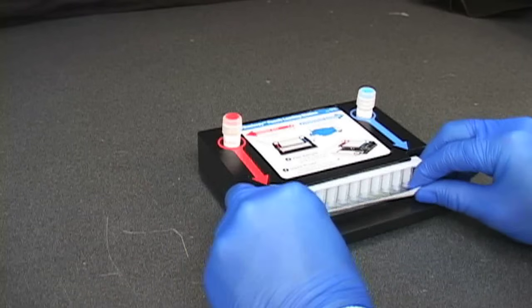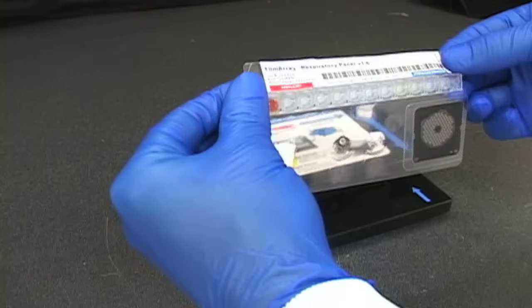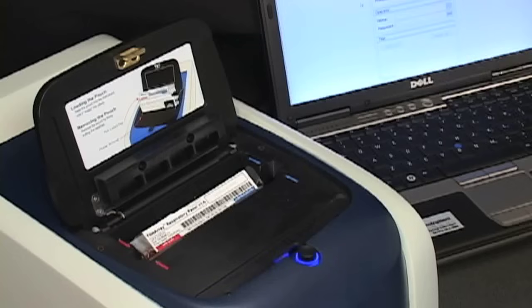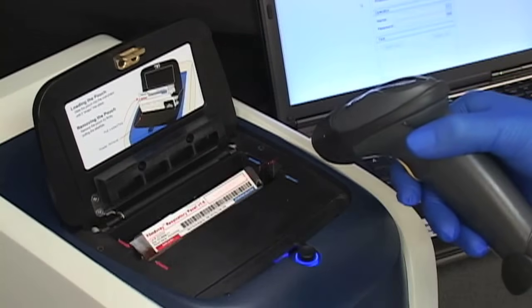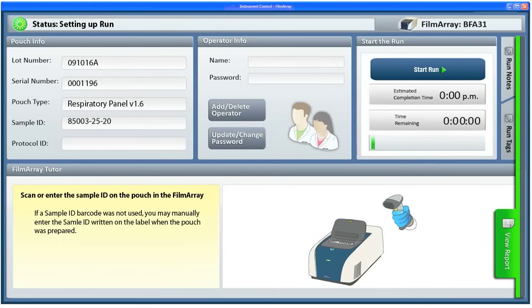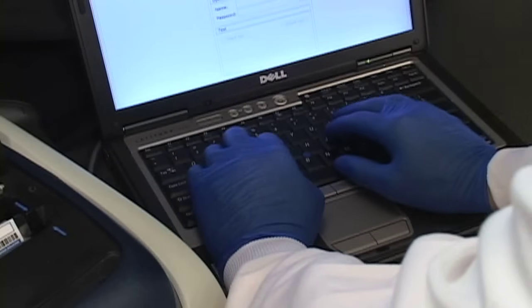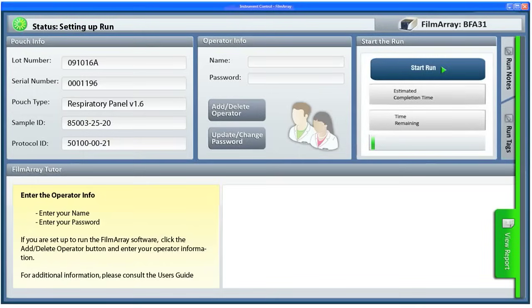The FilmArray instrument is now ready to set up. The FilmArray pouch is loaded into the FilmArray instrument and a barcode reader is used to enter the pouch ID. The sample ID can also be scanned with the barcode reader or entered manually. Last, the user ID and password are entered and then the run is started.